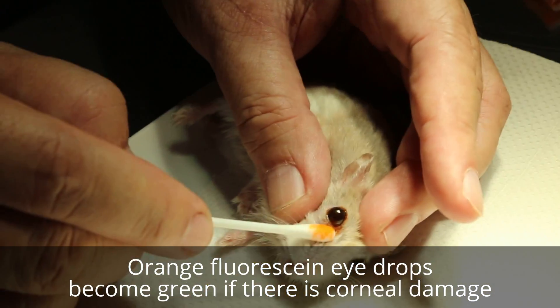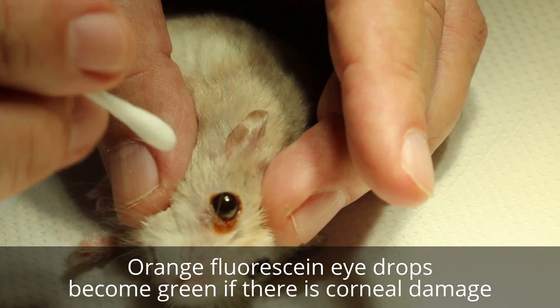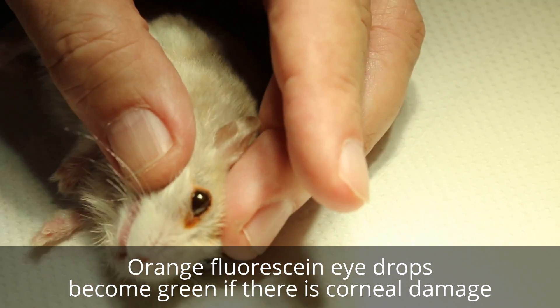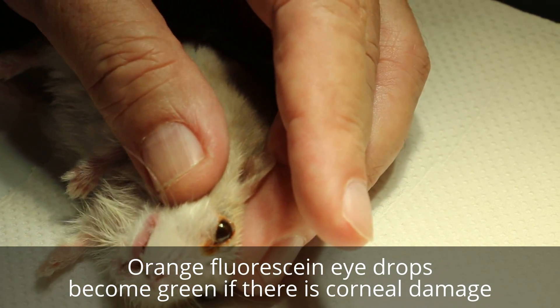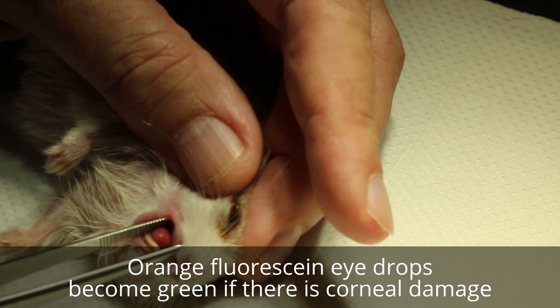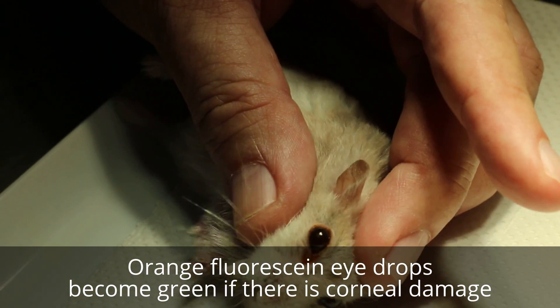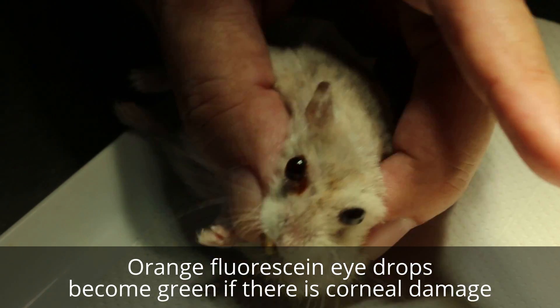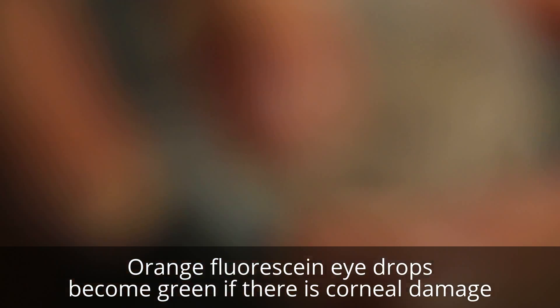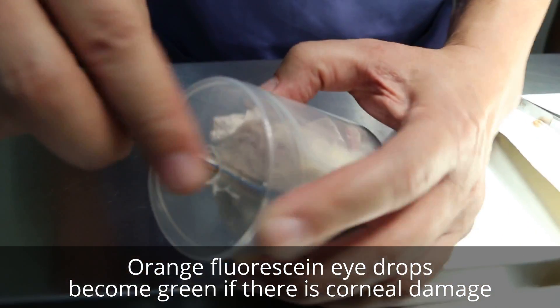Is there any green? Yes, this area is green. Early on it was more hairless like this. Now I will anesthetize again and then flush again, then check the upper and lower eyelid and irrigate the eyes.